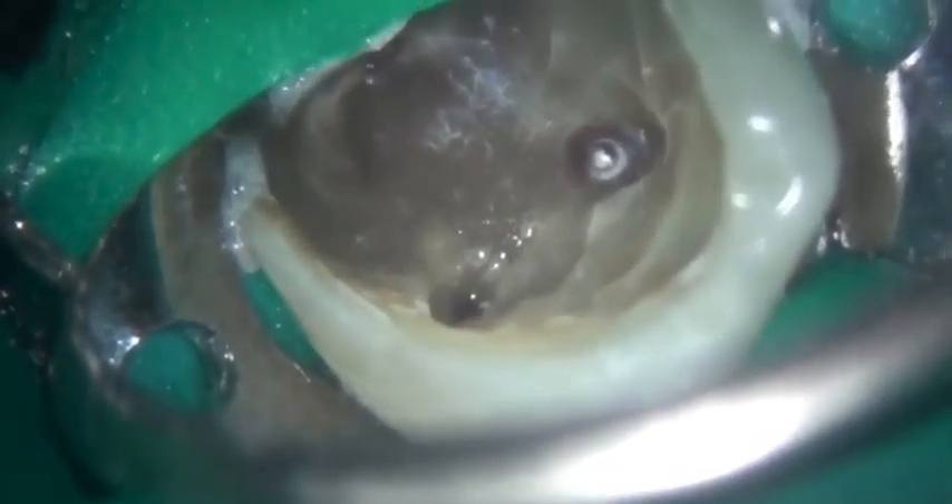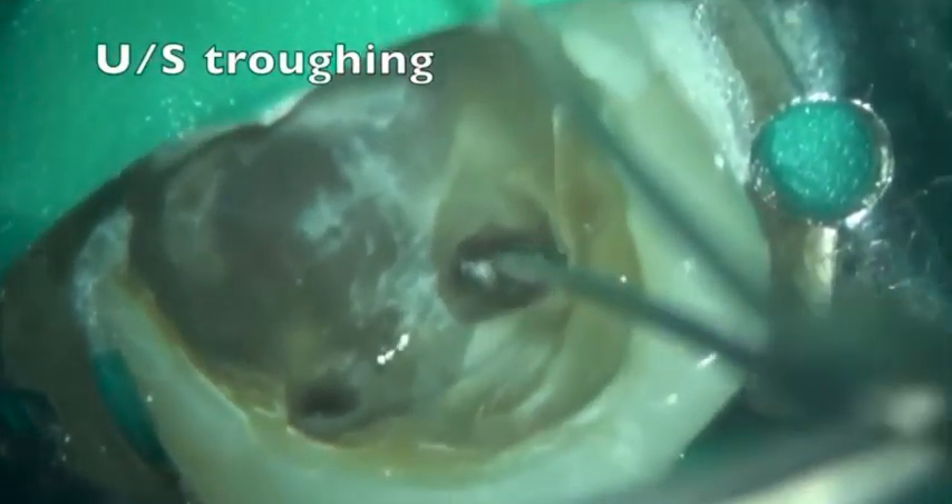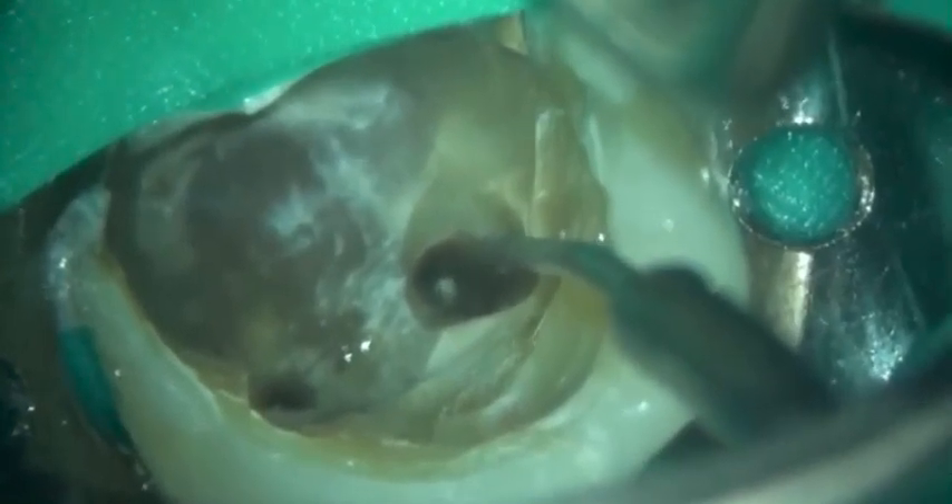High magnification shows a little donut of dentine around the head of the instrument, and this is removed by troughing with an ultrasonic tip. Here a fine ultrasonic tip is being used to trough around the head of the instrument.